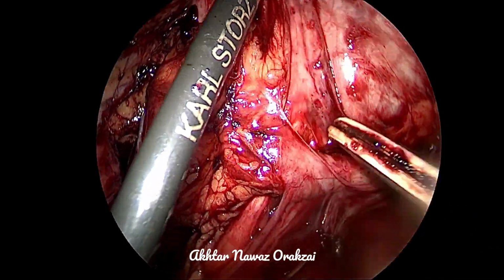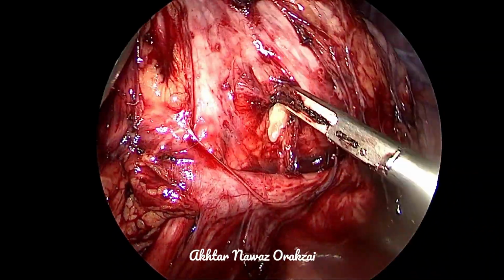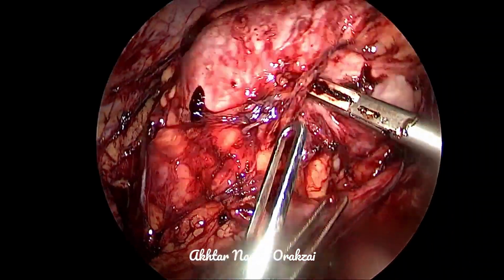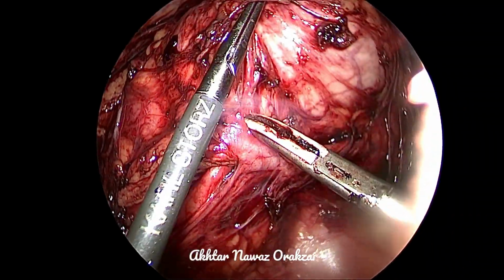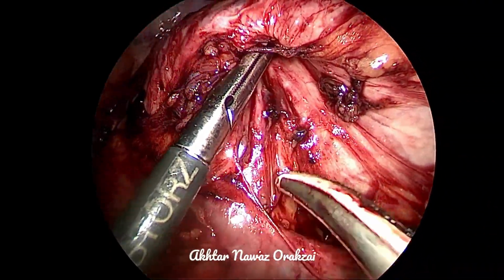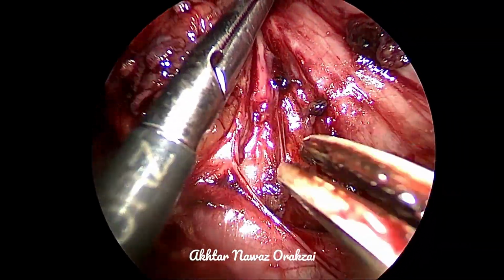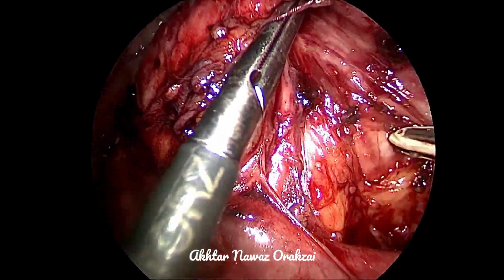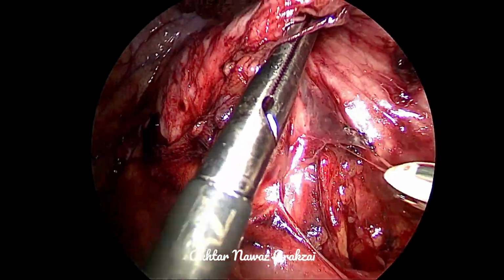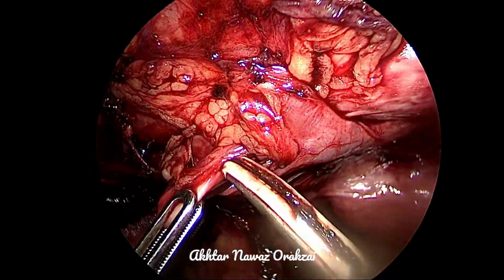So then we grab the renal pelvis and we pull it upwards. So this is the sequence of dissection for pyeloplasty in lower polar crossing vessels. You dissect from below the ureter, and then you pull the pelvis and the PUJ above. You dissect it from there, and once you do that, you come to the ureter again lower down, and you pull the ureter towards yourself, and then you dissect more. So slowly and gradually the PUJ and the pelvis are dissected away from the vessels, avoiding injury to the vessels.